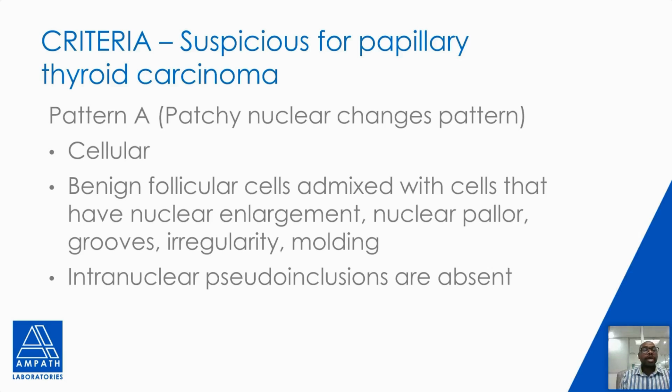So it will be hypercellular, and you'll have benign follicular cells mixed with cells that have nuclear enlargement, nuclear pallor, grooves, irregularity, and molding. And then intranuclear pseudo-inclusions are absent in this lesion.